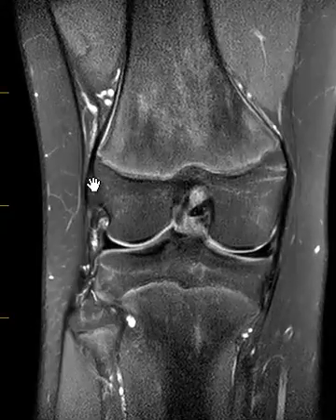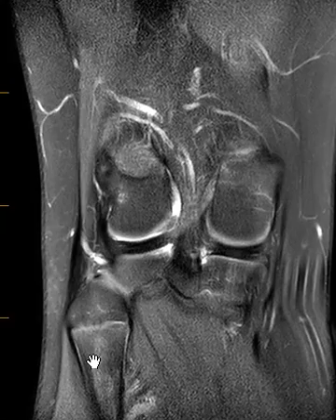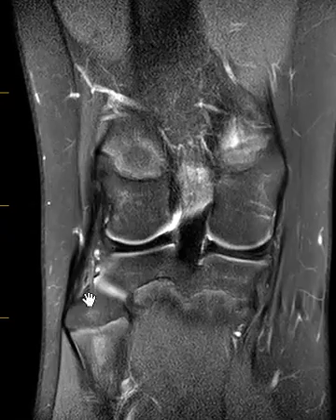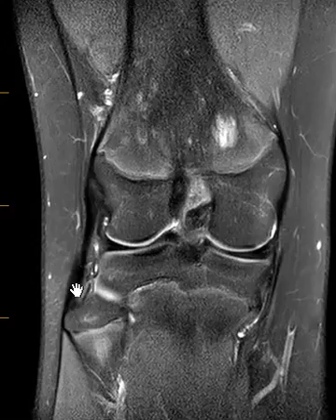This is the femur and over here we have the fibular collateral ligament coming down obliquely to the fibula, the little bone in the leg. This is the tibia, the big bone. We see this oblique dark band — this is called the fibular collateral ligament, one of the lateral stabilizers of the knee.